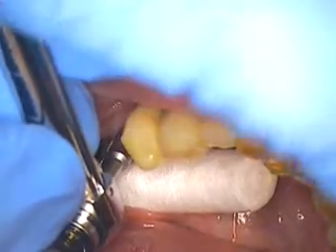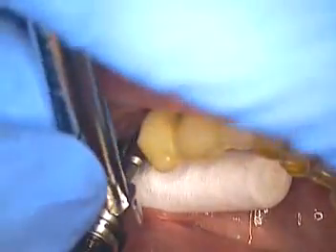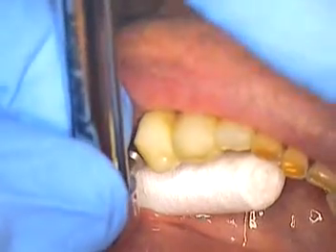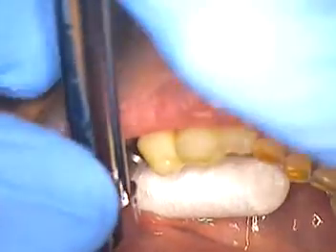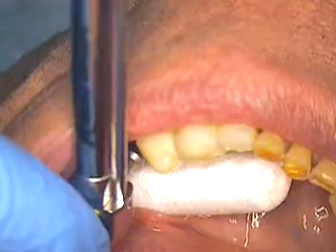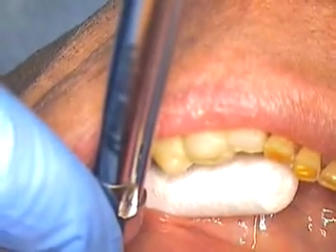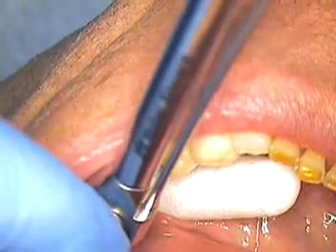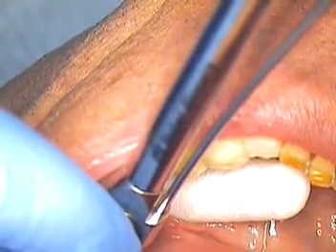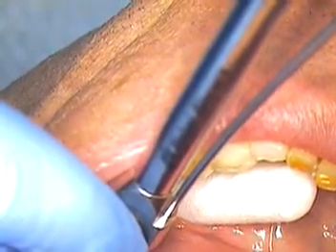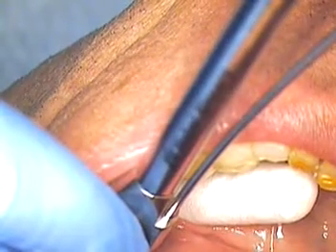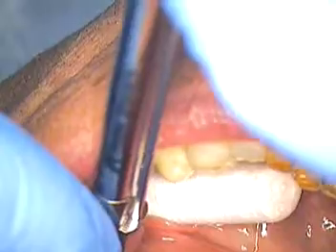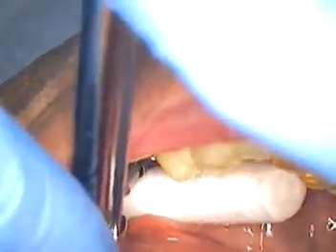We'll put our driver back in, and I walked away for at least 10 minutes just to see if there's been any contraction going on. I'm going to hold the top of the driver, and we'll torque it down to 30. This is the first one, so it goes down to 30. And that should be it right there. That's 30. No more than that.